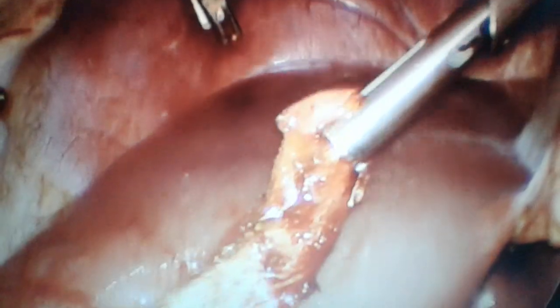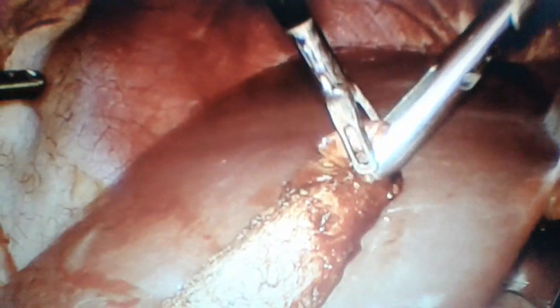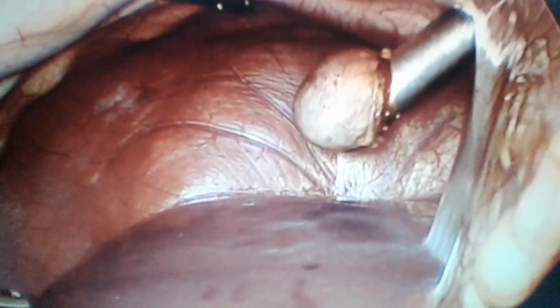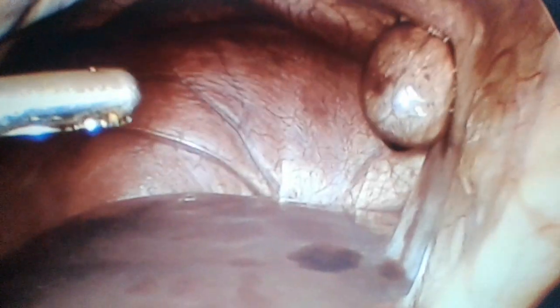And even if something at microscopic level, you can very well always say that, sir, at the microscopic level there may be contamination of the epigastric port, but that can be taken care of by copious irrigation. And here you can see almost more than 60% of the gallbladder wall is inside that 10 mm port, and through that 10 mm port we have taken out the gallbladder.